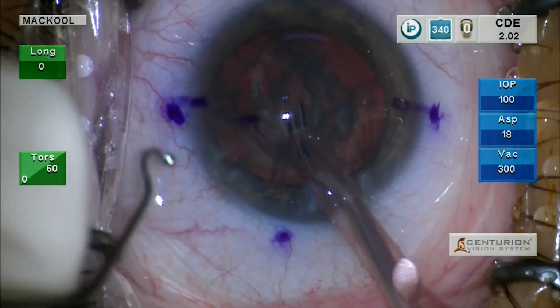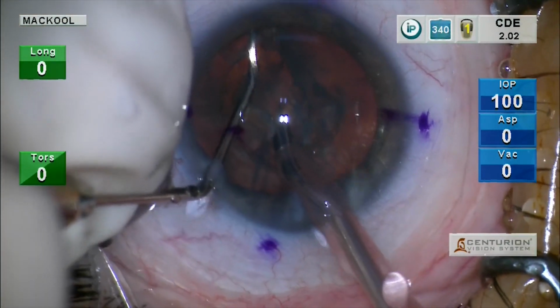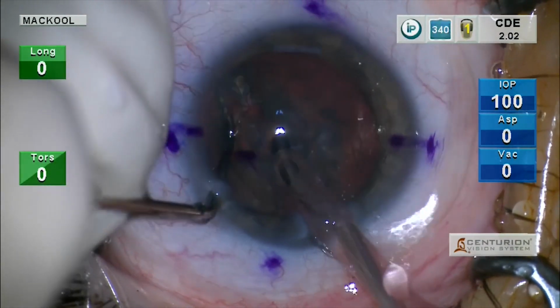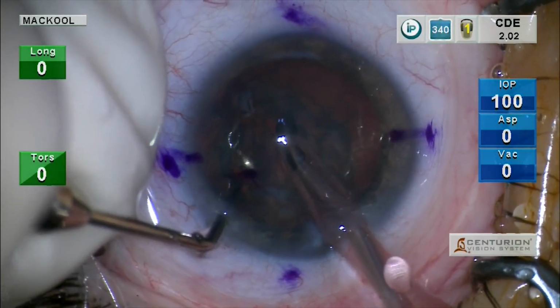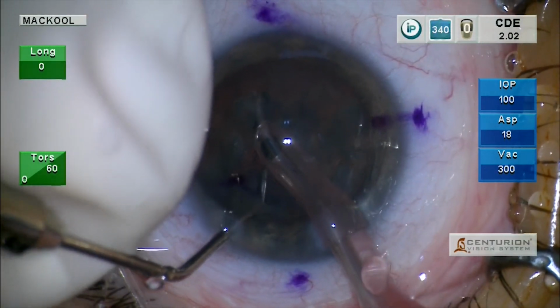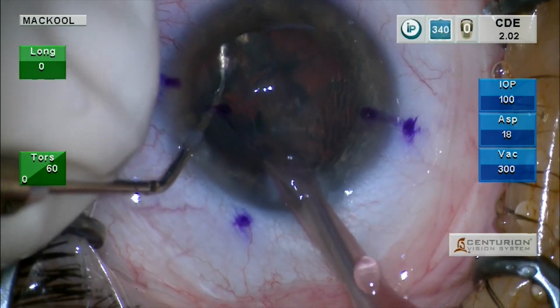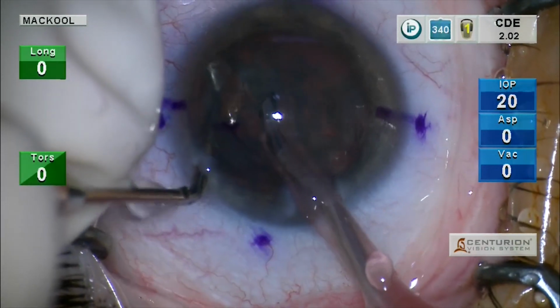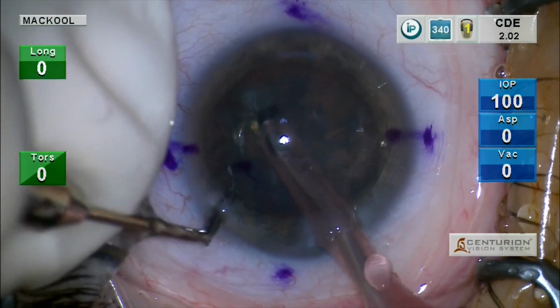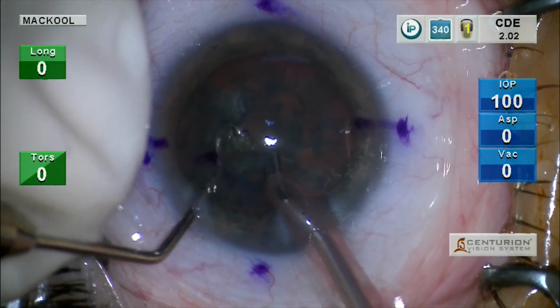I would be using this chopper. And the chopper would go out over the equator and be tilted downward, and I would chop it like that. And then two-handed rotation, chopper on sculpted wall, under the capsule, verticalized, meaning pointed downward, and the chop performed.